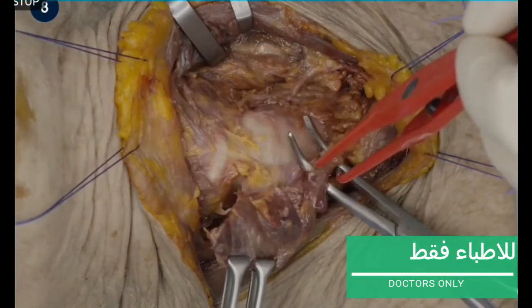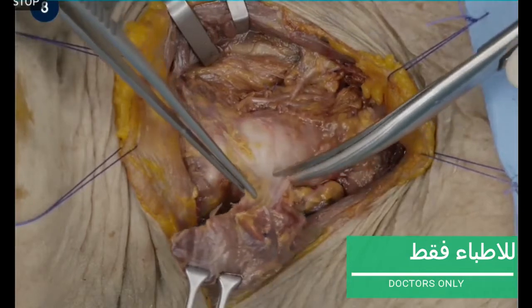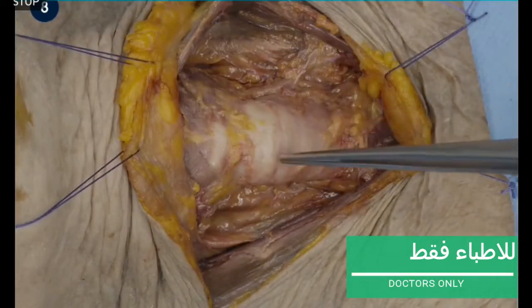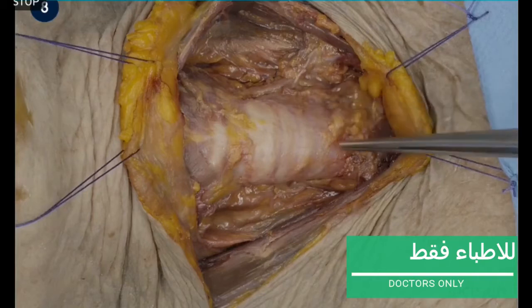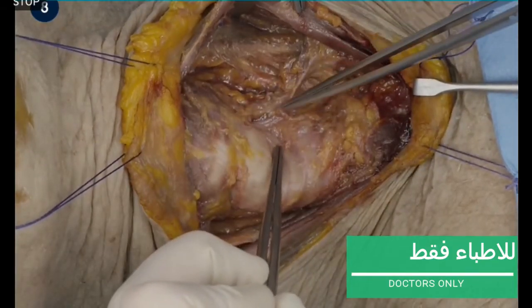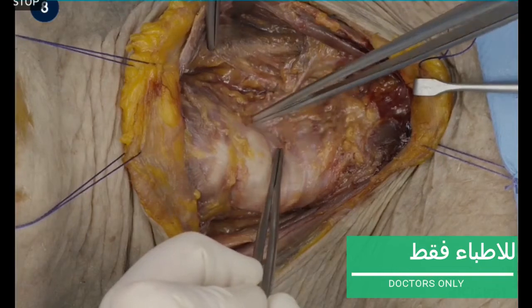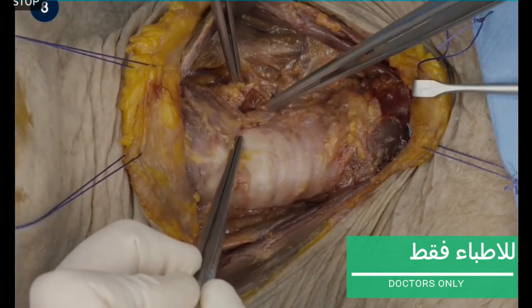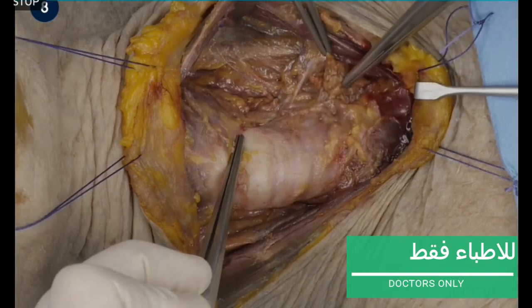The ima vein is ligated, after which the thyroid gland is completely freed. In this overview after thyroid resection: this is the trachea, the recurrent laryngeal nerve and its entry point into the thyroid cartilage, and the superior and inferior parathyroid glands.